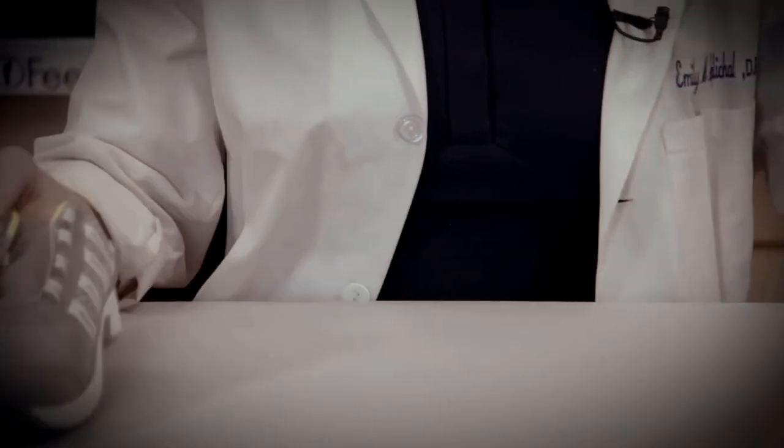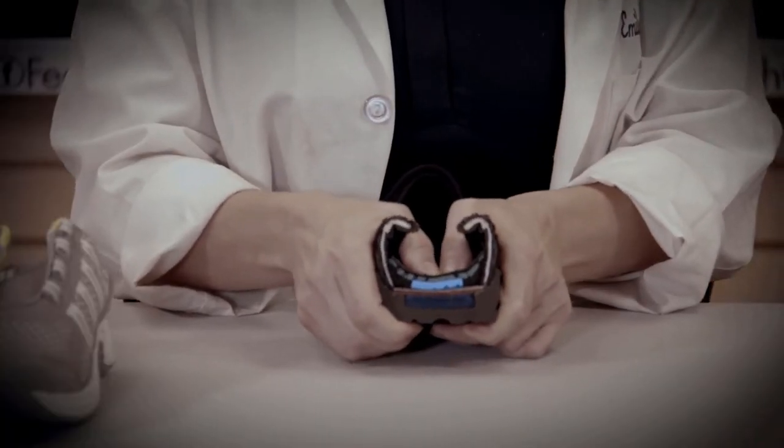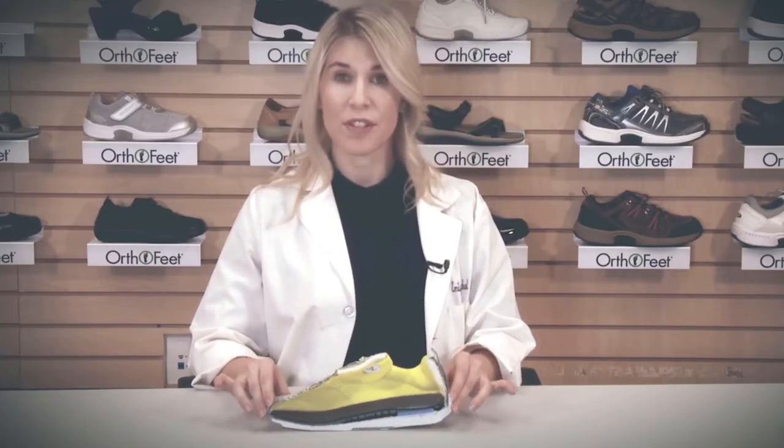It's also offered in the slip-ons to provide additional support and comfort. Some of the benefits of having a sole with a mild rocker is that this increases the ease of walking, requiring less motion in the joints of the foot. This is particularly important if you have arthritis in any of the joints in the foot, from the ankle all the way to the front of the foot.